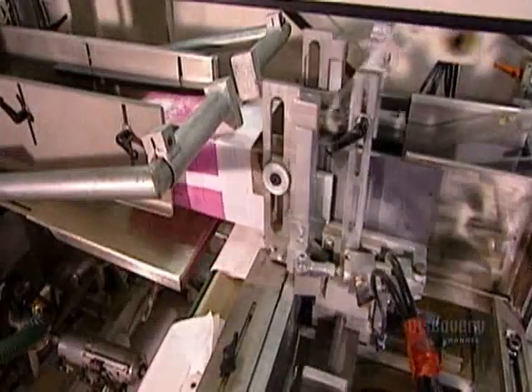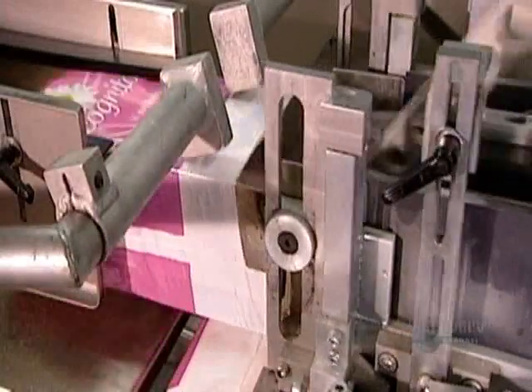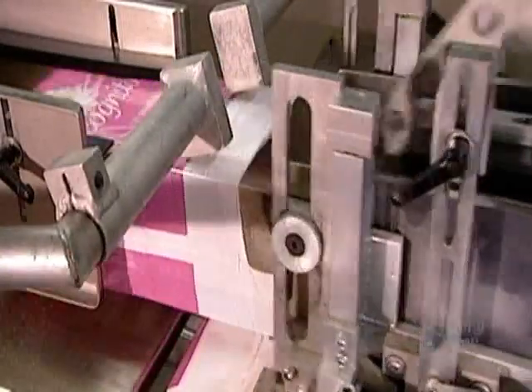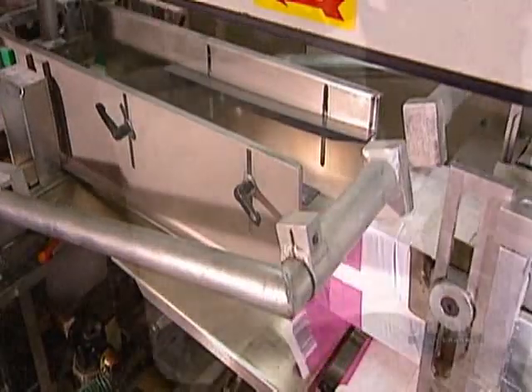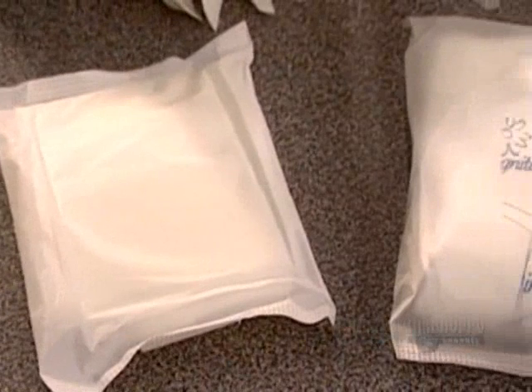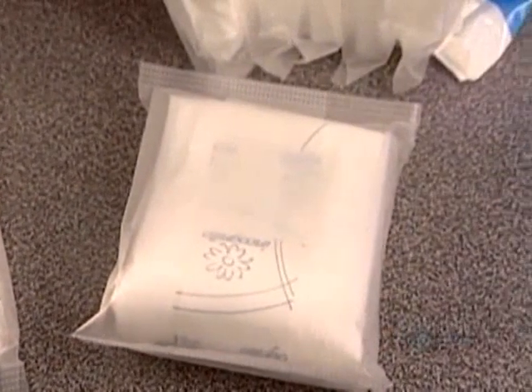As a vacuum opens the bag, a mechanical arm inserts the pads. The equipment then seals the bag shut. Everything you've seen happens at an impressive pace. From start to finish, it takes just 40 seconds to make and package a sanitary napkin.